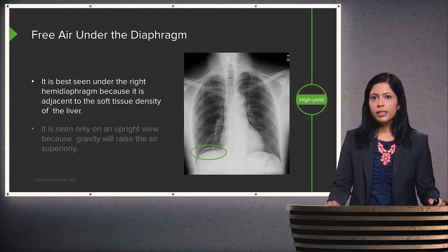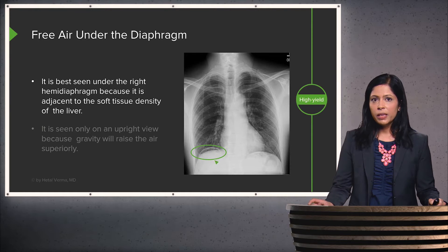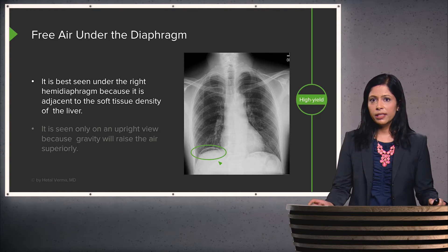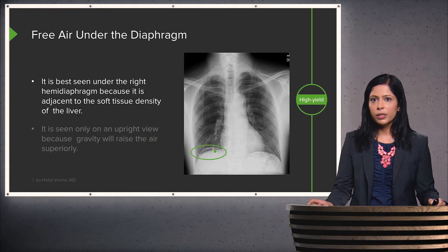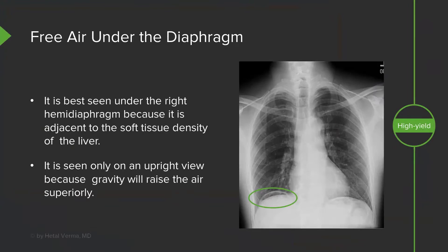On this upright chest X-ray, you can see free air under the right hemidiaphragm. This is visible because of the adjacent soft tissue density of the liver below. Adjacent to the liver's soft tissue density, any bit of air becomes visible. You can also differentiate it from the adjacent lung by seeing the line representing the diaphragm. This is really only seen on an upright view because gravity raises the air superiorly, placing it under the diaphragm.